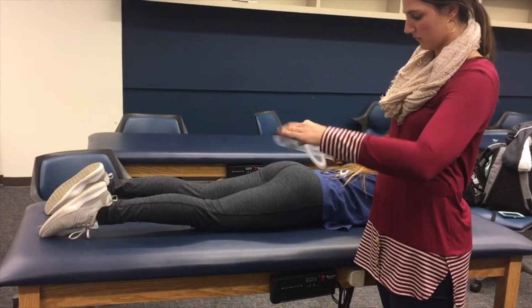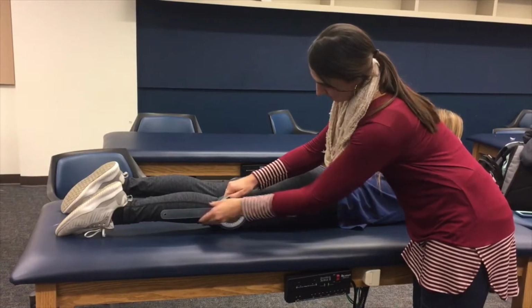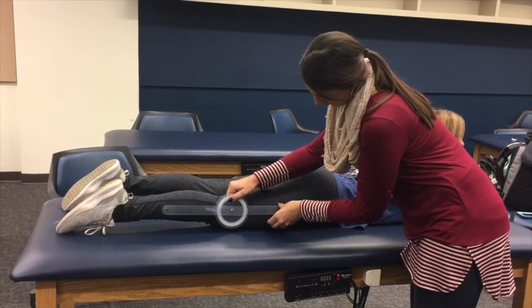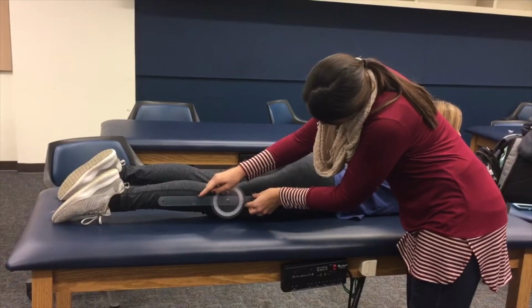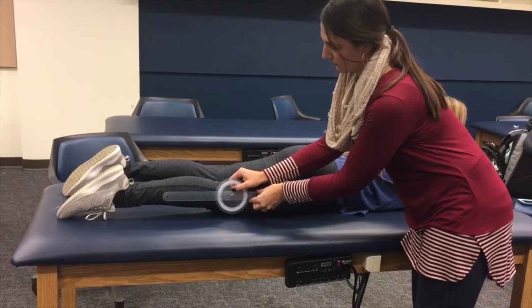The axis is centered on the lateral aspect of the knee at the lateral epicondyle of the femur. The stationary bar is placed on the lateral aspect of the thigh, parallel to the longitudinal axis of the femur. The movable bar is parallel to the longitudinal axis of the fibula. It is aligned with the lateral malleolus on the lateral aspect of the leg.